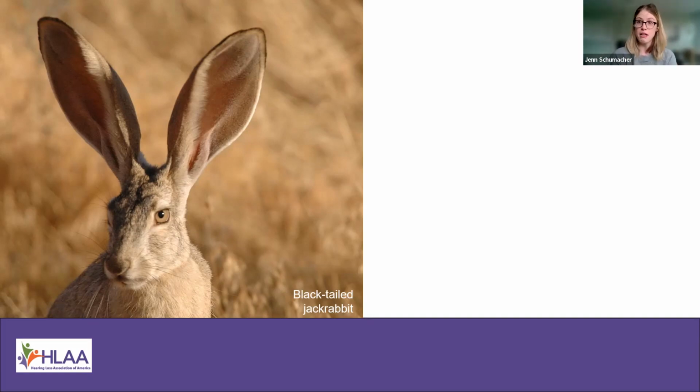And just like this jackrabbit, his ears and his face, he's kind of pointed in one direction. We can assume that he's probably listening for a sound in that general area, while those huge ears and the big back of them almost act like a shield that blocks out everything behind him that he doesn't want to pay attention to. And really, we use these directional microphones in hearing aids to almost recreate that same effect.